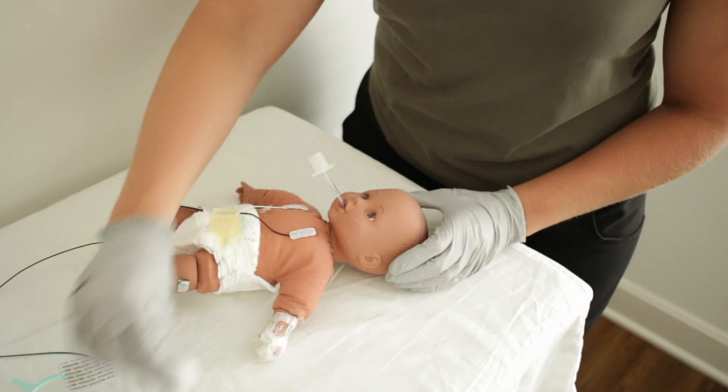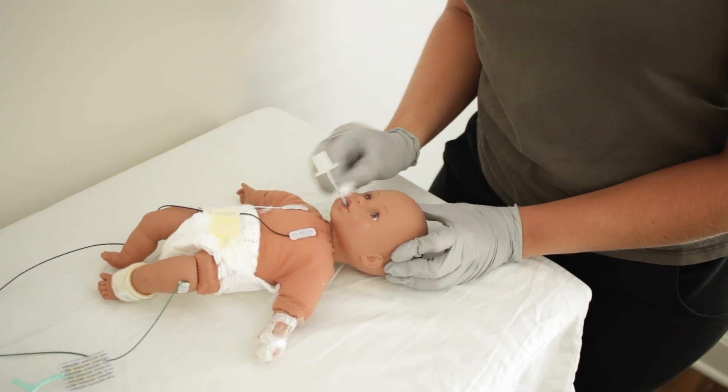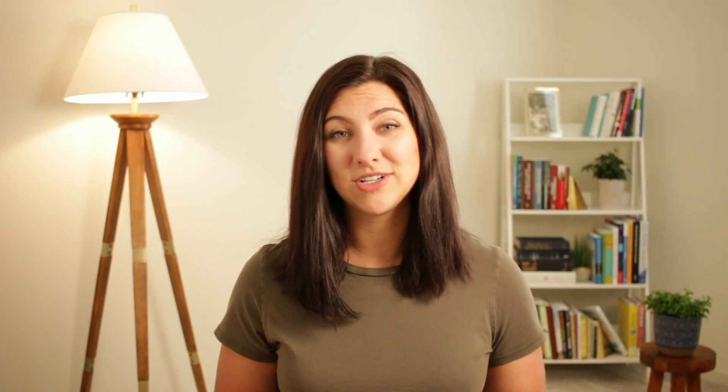To clean the skin, typically sterile water on a 2x2 works well. You'll also want to make sure that you are drying the skin. It is incredibly important that you do not use an alcohol swab to prep your patient's skin, as this can be incredibly drying to their skin and very irritating.